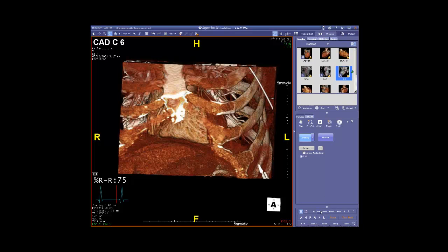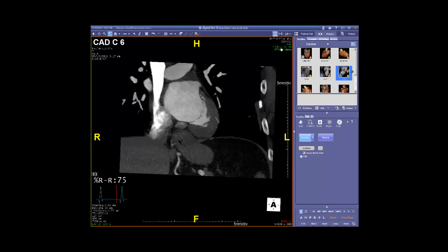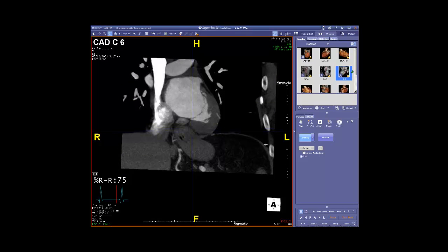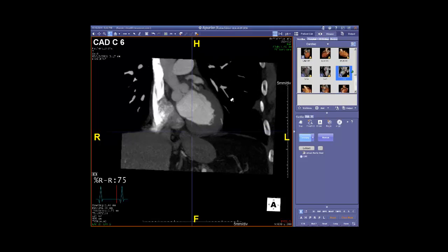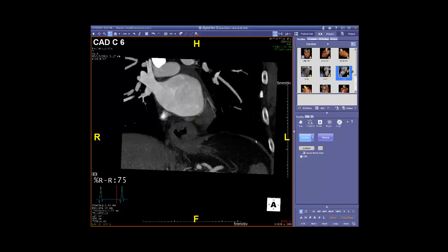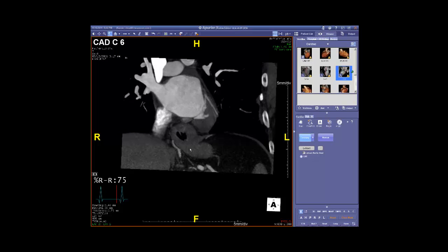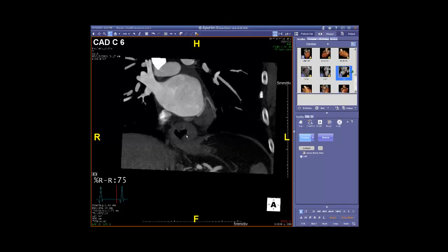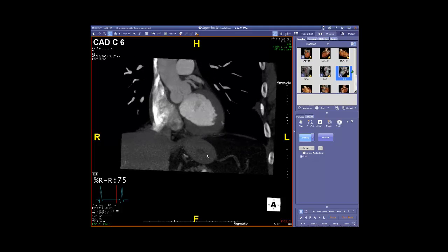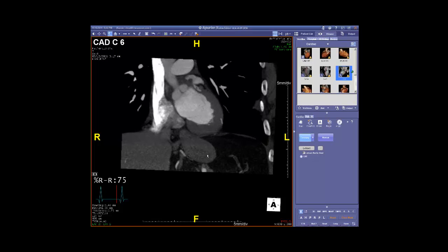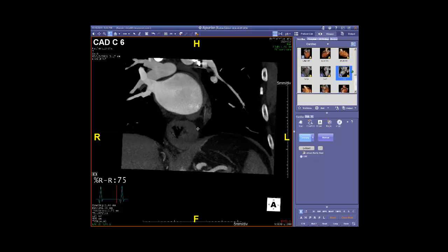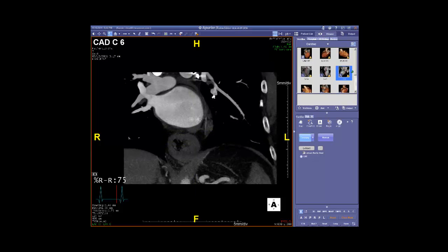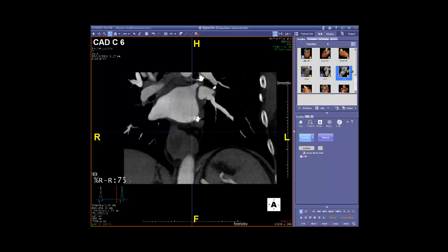This is his study done in the ER. I'm going to start in our case review and go to a MIP — this is a five-millimeter slab thickness. As we pan back and forth, one of the things I wanted to point out: if you look here, you've got the diaphragm, and this is actually the stomach. This patient has a large hiatal hernia that's bulging through the diaphragm. Beyond the history of his lateral chest wall surgery, another potential source of chest pain in these patients is gastroesophageal reflux and a hiatal hernia. You may notice there are some metal clips showing up here in the left mediastinum — these are residuals from his prior surgery.